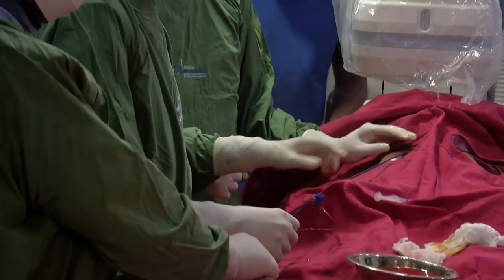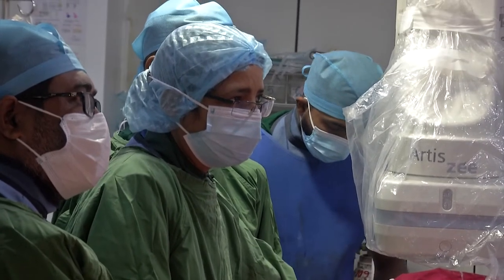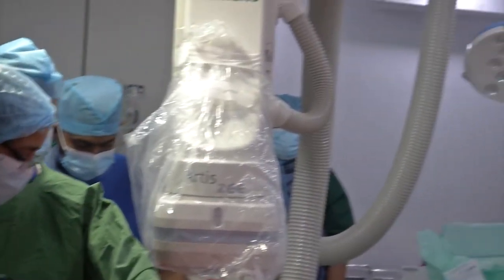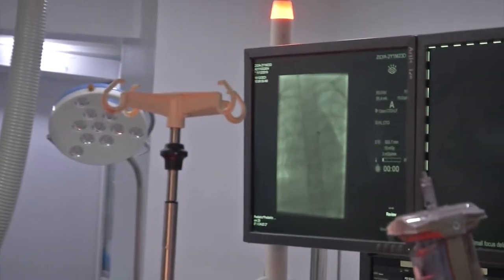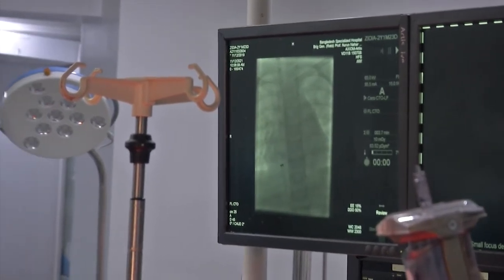So this is again inside the pulmonary vein. I will try, you take a cross. So you have crossed already. And now we will check whether there is free flow. Again, we will check whether there is free flow of blood inside the delivery system. This time there is very beautiful free flow.